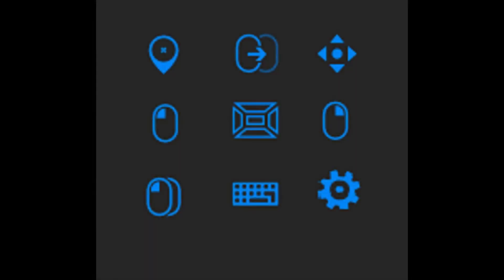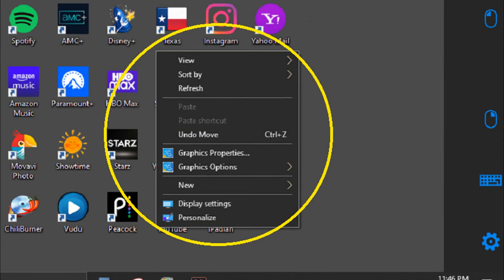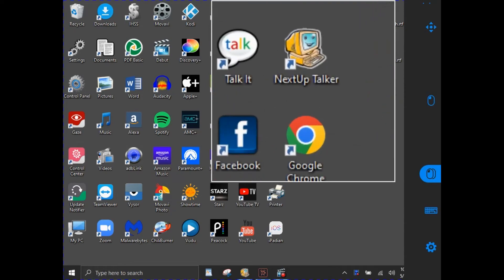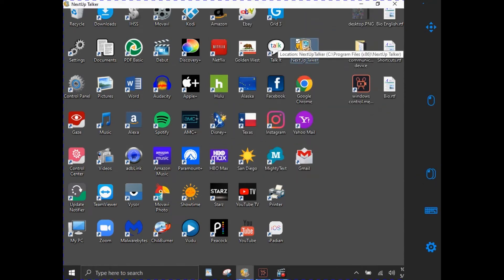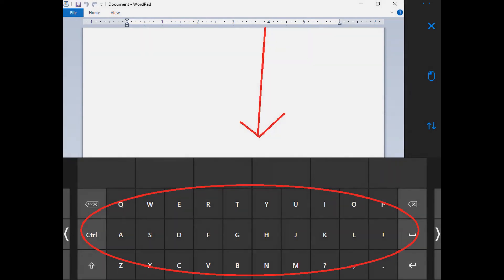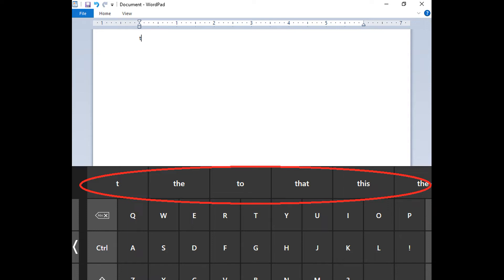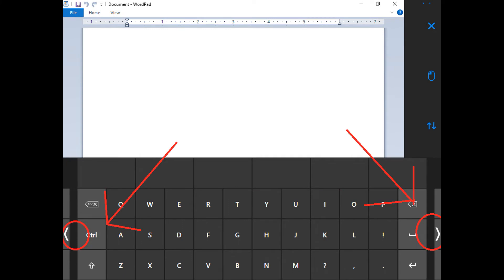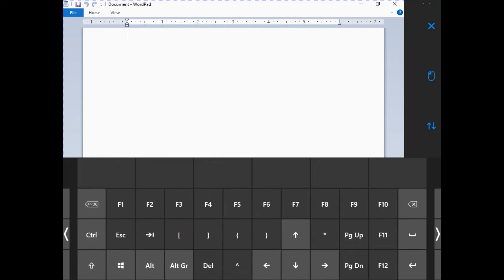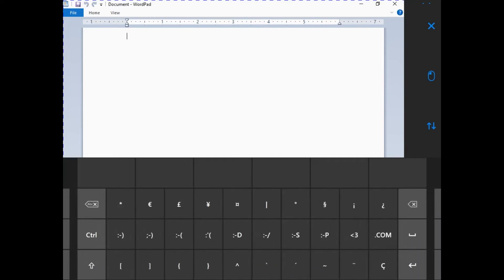The next icon is the mouse right click. It's used to give you additional options for an icon, page, or program. The double left click icon is used to open programs and apps from your desktop. The next icon is the Windows Control keyboard. It's possible to modify this keyboard with a little programming. It has word prediction, which makes it quick and easy to use. You'll notice little arrows at the sides of the keyboard to scroll through the different keyboard option pages — it saves room and makes this keyboard quicker to use compared to most eye gaze keyboards.